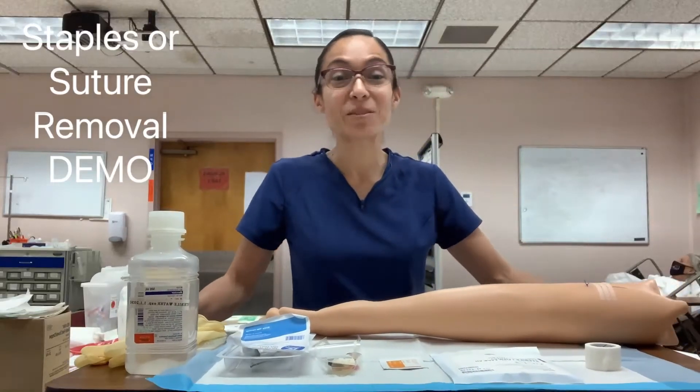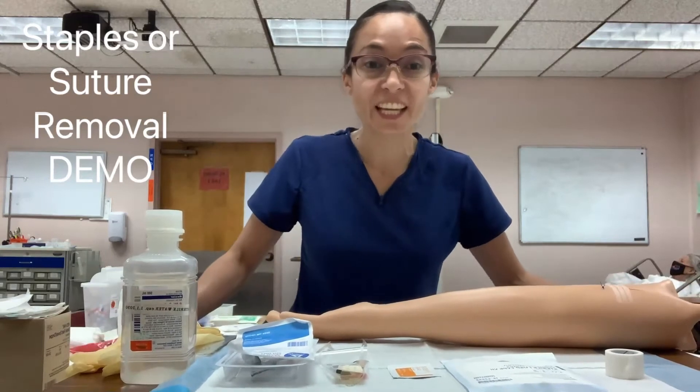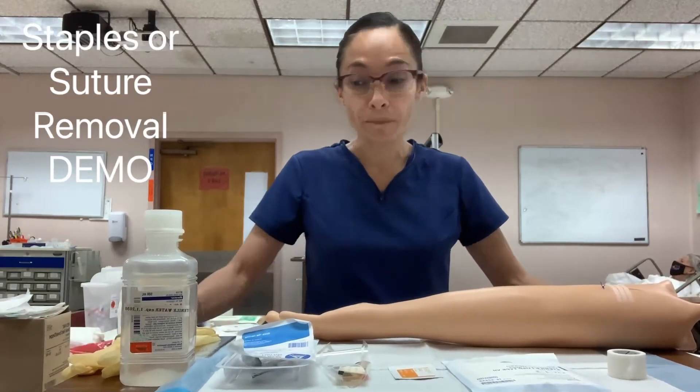Hi students, this is Mrs. Bravo, and in today's video I am going to be demonstrating the skill of staple or suture removal.